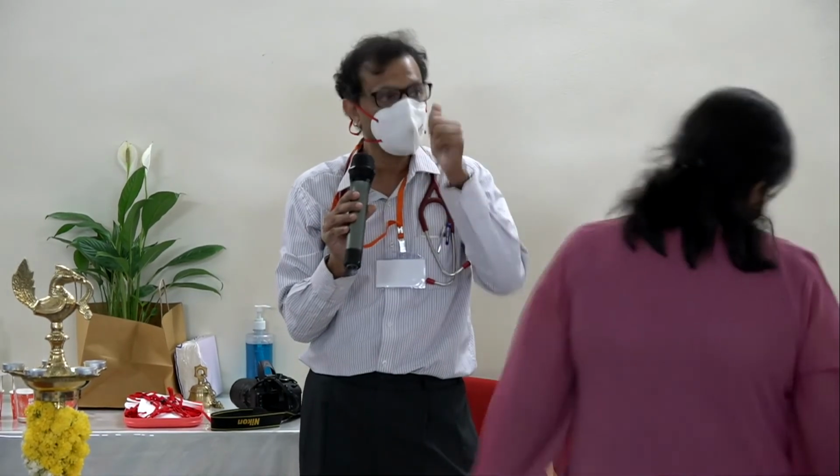What the machine also does is it gives you a little printout at the end of the process which tells you the fiber bundle volume and the pressure leak test result. So we insist that that has to be stuck on the patient's paper so that at least we can check at random from time to time, because otherwise, if that step is bypassed, unfortunately, just about everything in our technology has a mechanism by which you can bypass the safety. We will be showing you in the course of this what all can be bypassed.